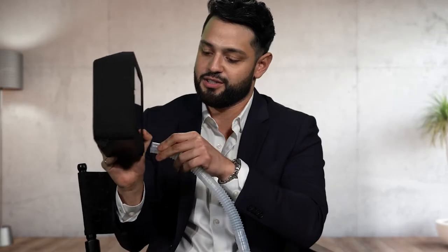We've printed so many unique objects across our campuses. Typically we print things such as task trainers like trach plates, which standardized patients and students use when they're simulating that they've been on a vent. We've 3D printed metatarsals that go inside fingers and toes so that they can feel the areas and the markers that they need for digital blocks. We've printed actual full knees, the entire bone structure that goes inside of knees.